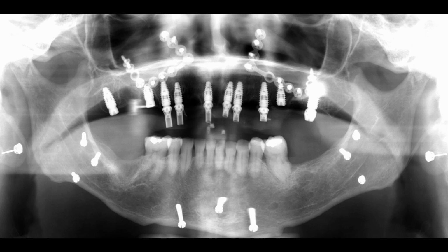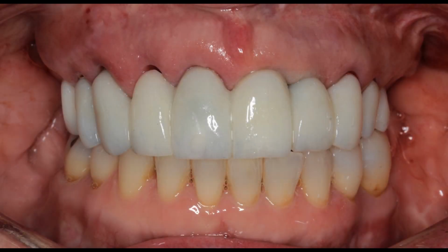So she leaves here with her fixed temporary, and you'll notice that the temporary fits up against the gums very intimately, and that's the goal of these temporaries. I've worked with this protocol and this process for 30 years. Started on teeth, carried it over to implants, and this is the result of 30 years of kind of trial and error that got us to this point. So that's the day of surgery.